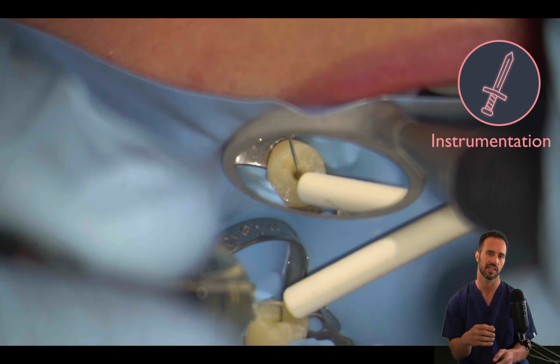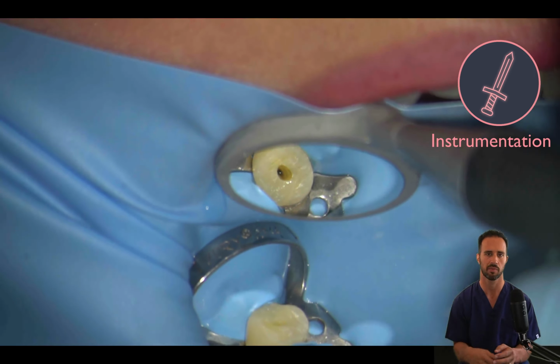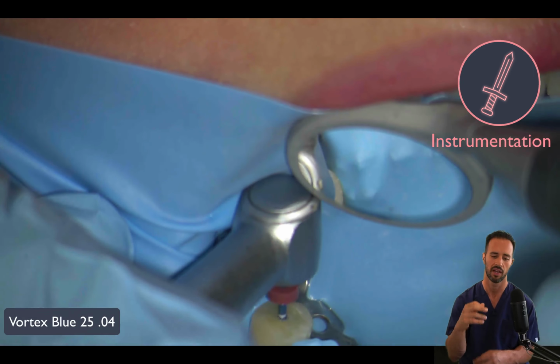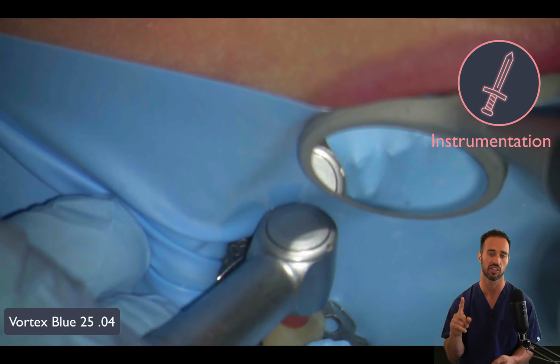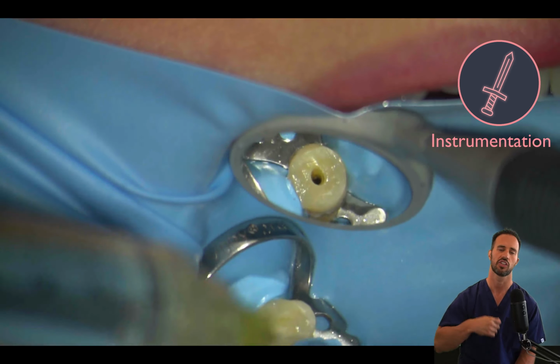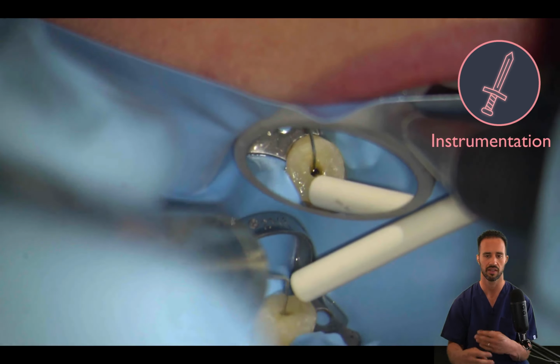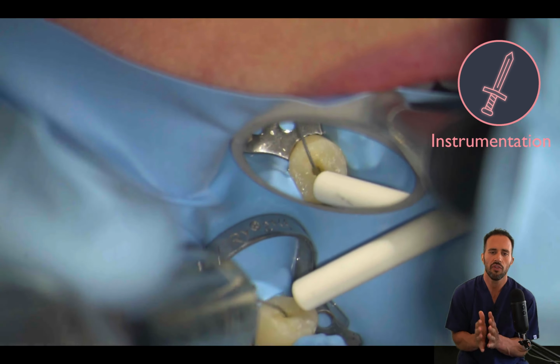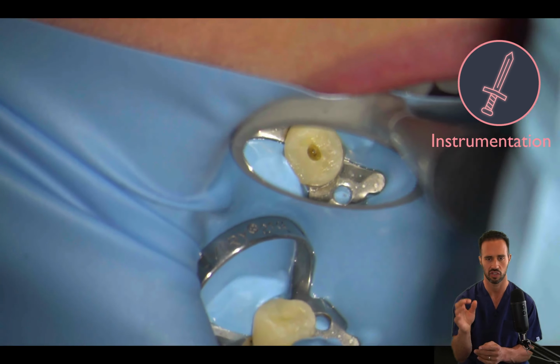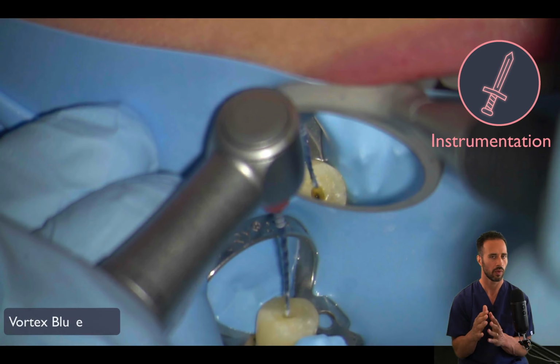You know, when you're starting with the size 15 and working your way up, it's a very repetitive process, and that's nice. Your assistant appreciates that because he or she knows exactly how the procedure is going to go. And now we're with our size 25 Vortex Blue 04 rotary, and again sodium hypochlorite in between. And you will start to feel as you're working these files that you'll feel when the apical region of the file is engaging with the apex just by tactile sensation, and that's going to tell you that you've thoroughly cleaned. But we got a little ways to go here.